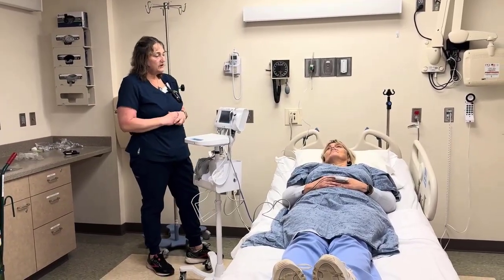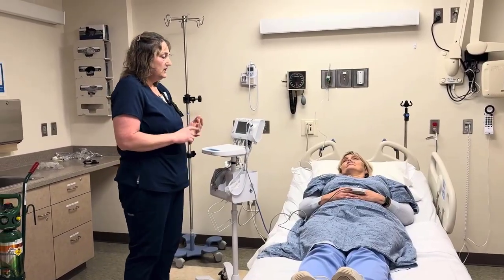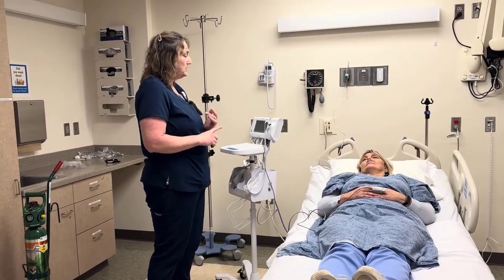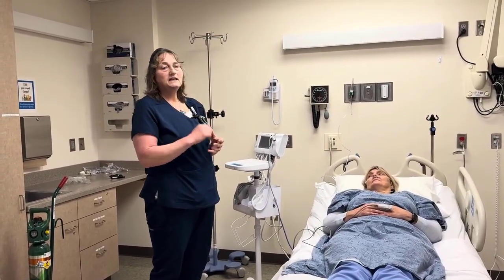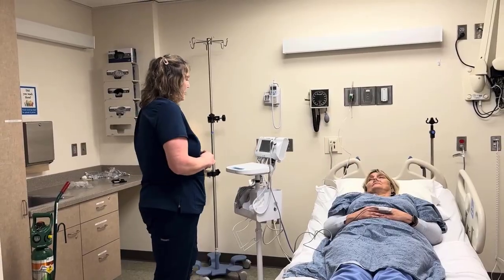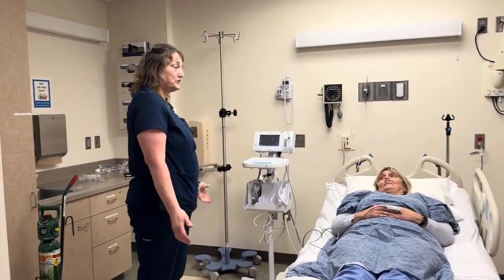Oh, that did it. So now you're above 88%. So now I can document that your oxygenation fell below 88% off of oxygen and that it took 2 liters to get her above 88%. All right, perfect. Now, Michaela, we're going to do the exercise test.